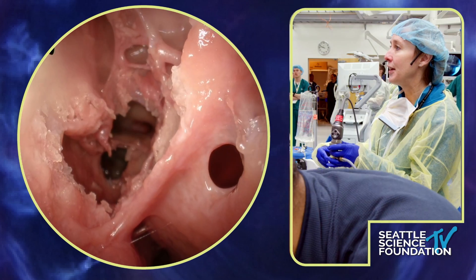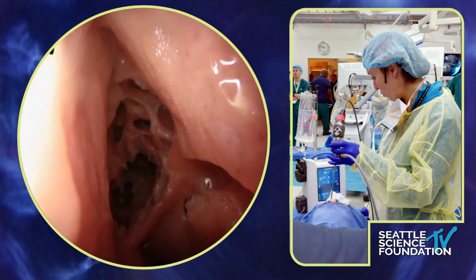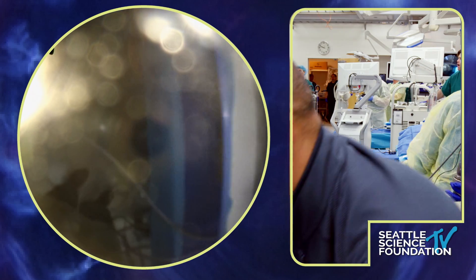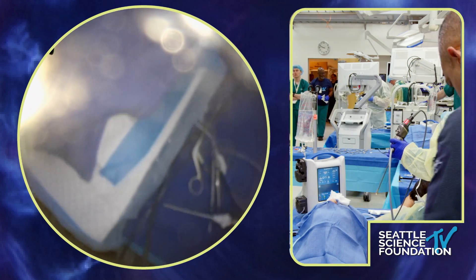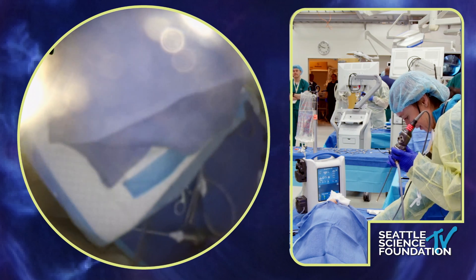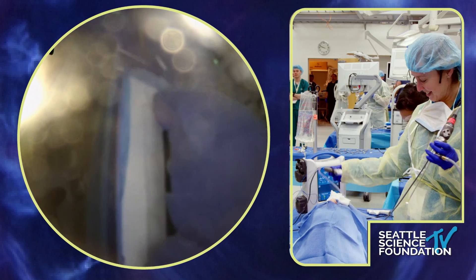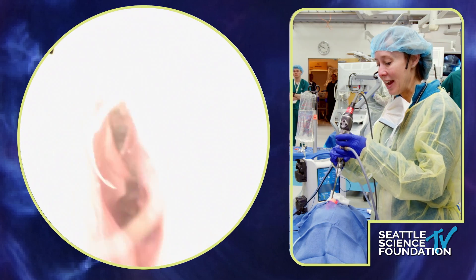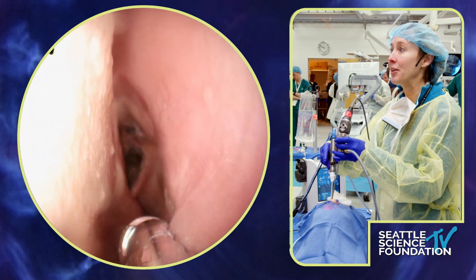You can see how that's different than the accessory ostia here. So once I've just made that one nice horizontal cut — I need to use my left foot, it's my bad knee — now to remove the superior portion of the uncinate, I'm going to go ahead and use the microdebrider.